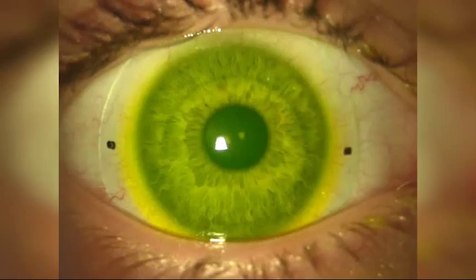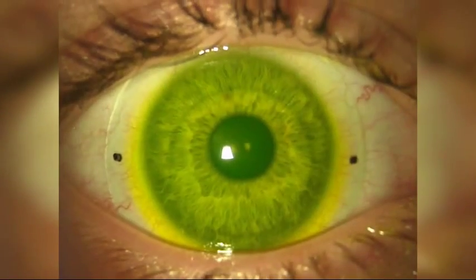Just as a saddle that's placed on a horse, you spin it around and it just drops into place. The same thing is true with the sclera.